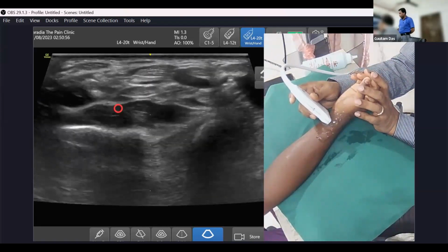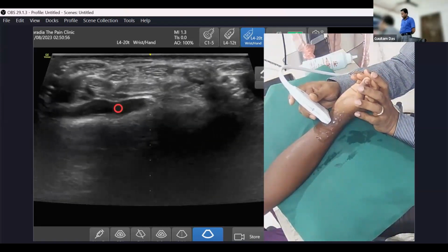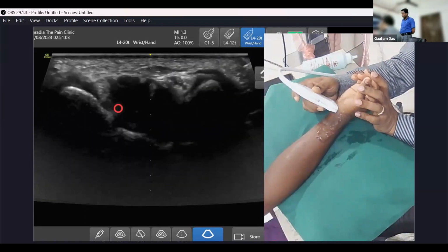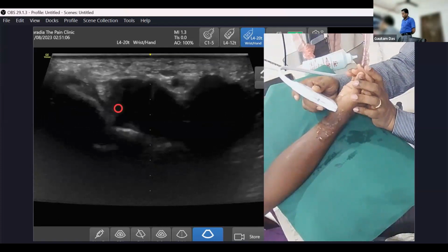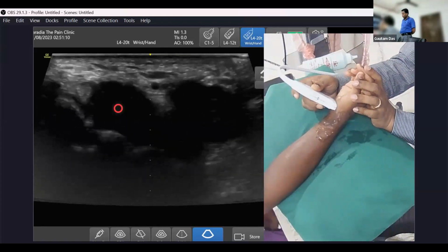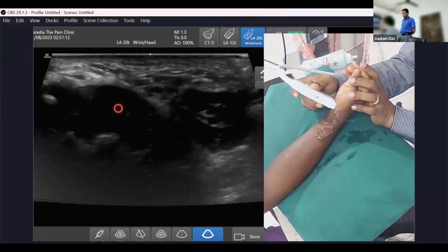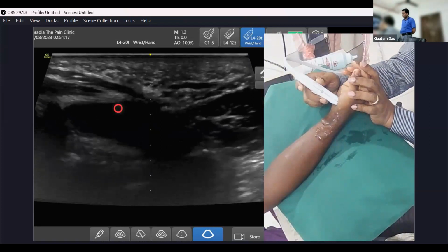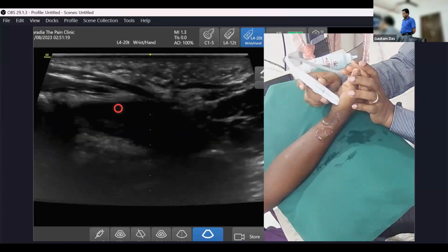Okay, so follow this ulnar artery again, pisiform and the scaphoid on either side. So this was your proximal carpal tunnel. I am now following the ulnar artery, going distally. So now one bone is starting. That is your hook of the hamate.